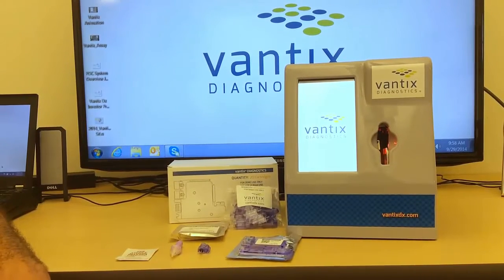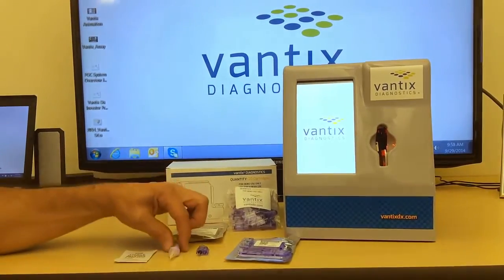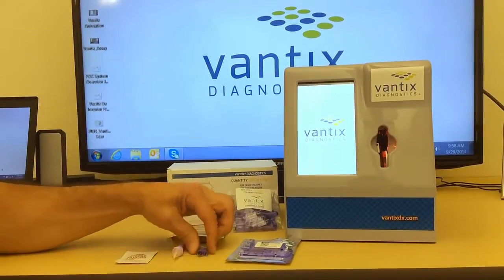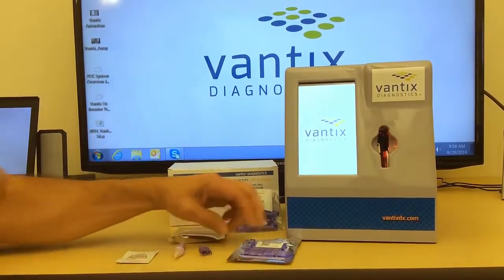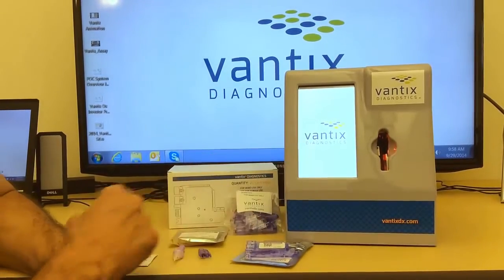This is a demonstration of the Vantix point of care platform. What you have here is the lancet, the sample transfer device, the disposable cartridge, and the Vantix reader.